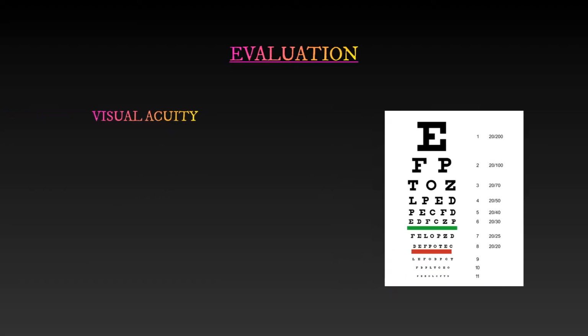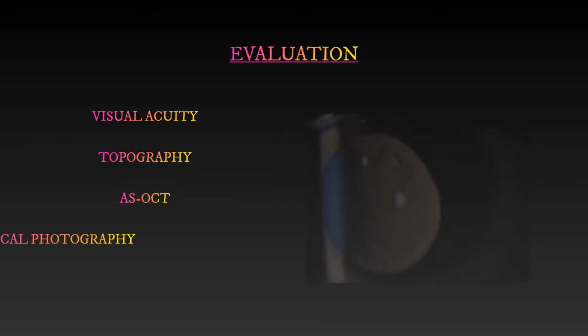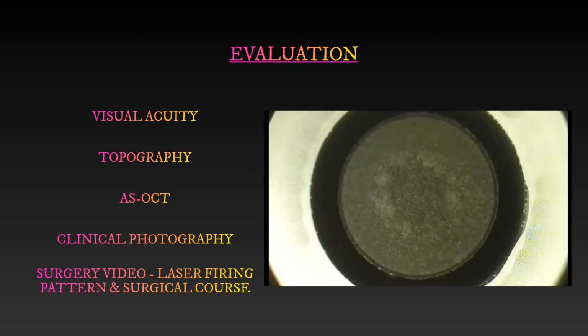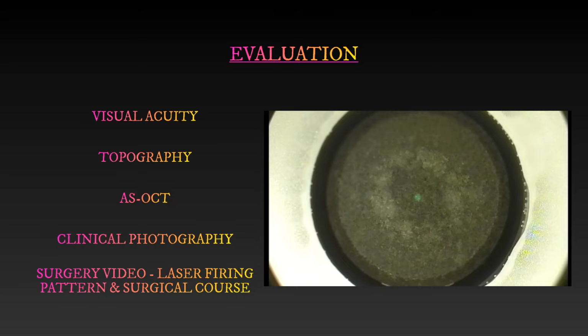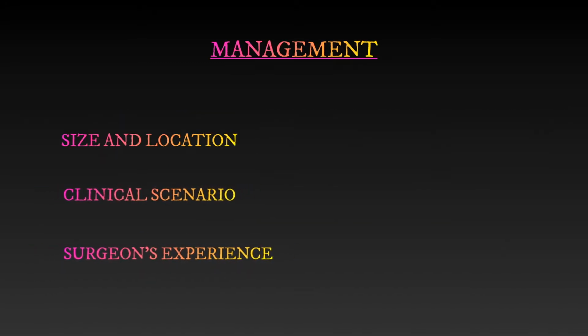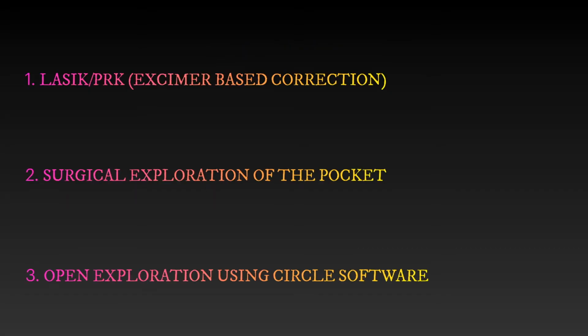Evaluation must include an assessment of visual acuity, topography, anterior segment OCT, clinical photography, and reviewing of the surgical video for quality of laser firing pattern and surgical course. Based upon the clinical scenario and surgeon's experience, the following approaches may be employed.